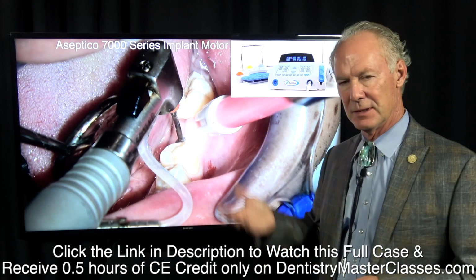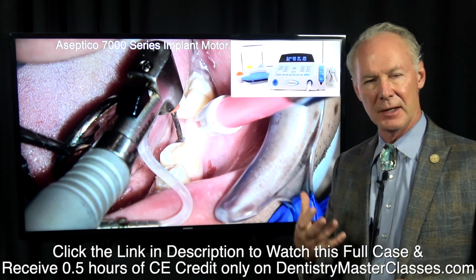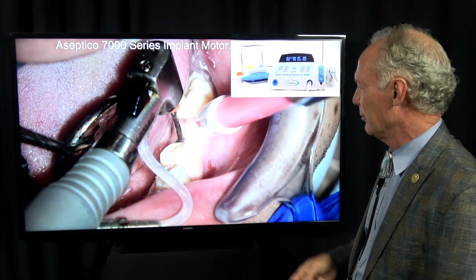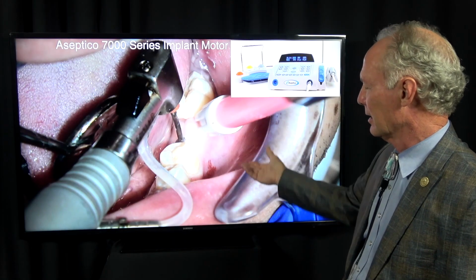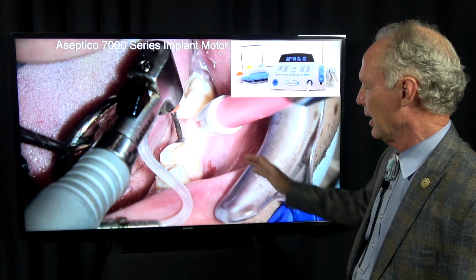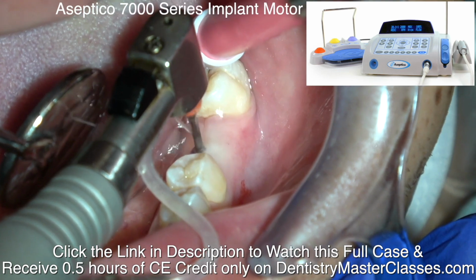I'd like to have at least 5 or 6 millimeters of the implant in bone. There are some 6 millimeter large diameter implants you can use. Typically, the shortest implant is 8 millimeters. So I want at least 5 or 6 millimeters of the implant to be in bone. This is just talking about the maxillary area. Now in the mandible, you want to stay a couple of millimeters away from the inferior alveolar nerve. You don't want to take any chances on damaging the inferior alveolar nerve.